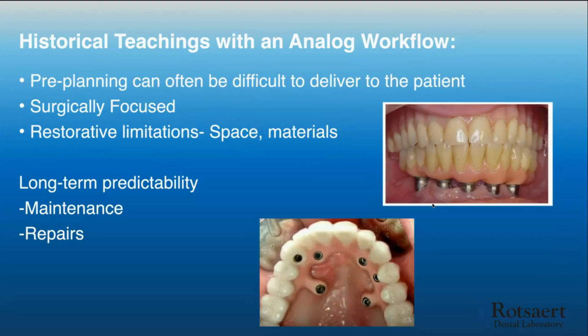The techniques are getting better, where now those screw access holes are more in the teeth. But again, we had to just deal with whatever was placed back in the day. We still even see here in the lab, we have a single central where the implant is almost 5 millimeters palatal to the envelope of the crown itself. A challenge, but it's avoidable in that case. Obviously, it integrated well, because those ones always do.